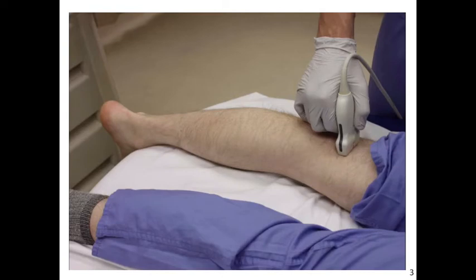The best positioning to perform this nerve block is for the patient to be prone. You can place the probe in the popliteal fossa in the transverse orientation as shown here. This is similar to the positioning that you would do for an ultrasound evaluation for DVT.